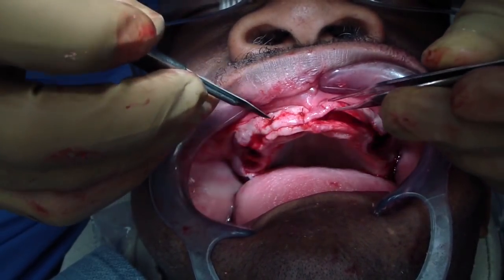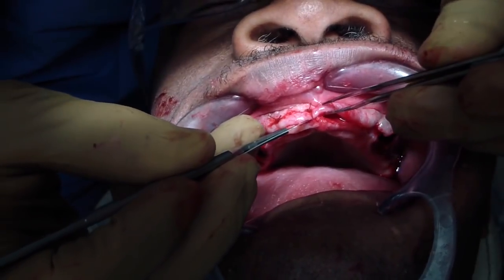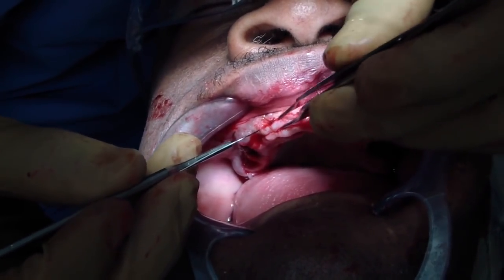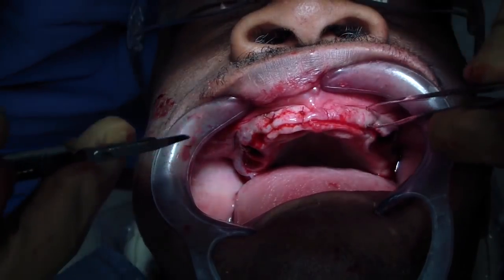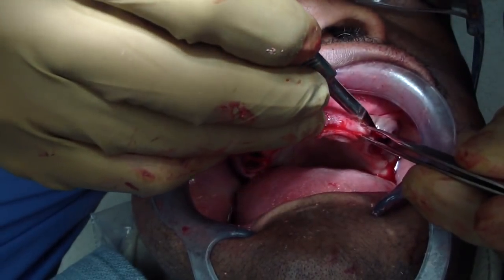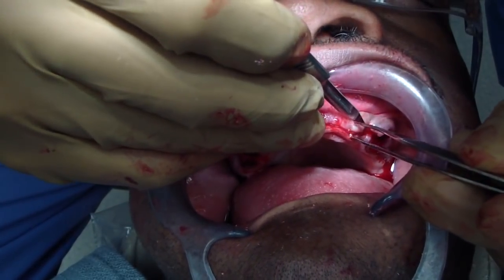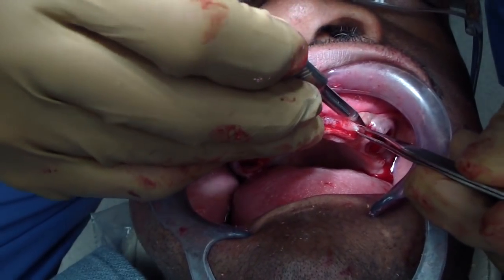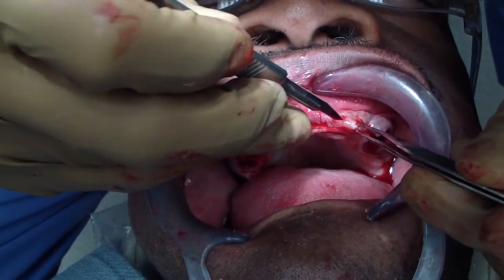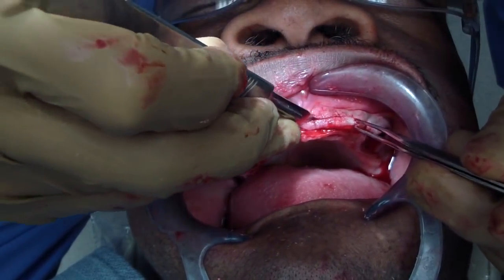There are different ways of doing this. I simply use the blade and my Adson forceps. You could do this preoperatively — i.e., remove the soft tissue by making a decision if you have an idea ahead of time. You could use scissors; there are a thousand different ways. The key point is to remove that excess tissue so you allow faster healing for the patient.